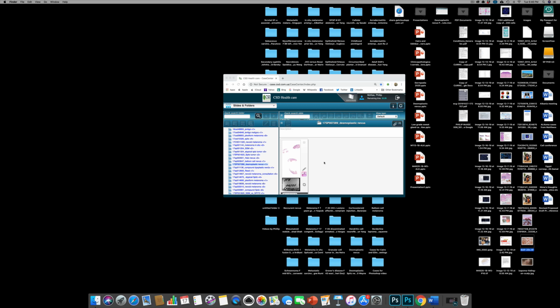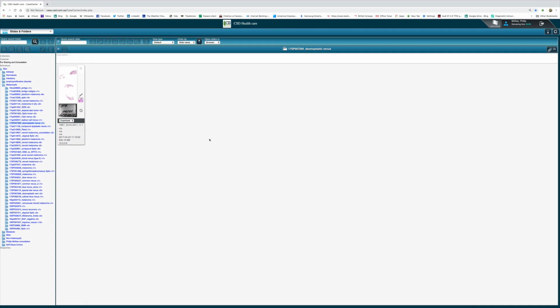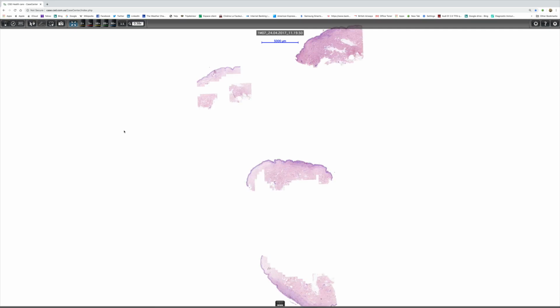I'm going to start this video by showing two cases that Antonina Kalmykova of CSD Healthcare in Kiev has kindly shared with me. And when we've looked at them, I'll have a short presentation on Desmoplastic nevi. So here's the first case. I don't have any clinical information, but we'll just have to make do without it.